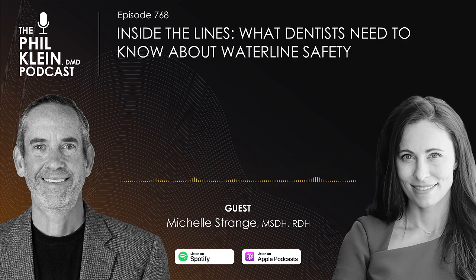It's the same thing in the mouth, right? It's your periodontal maintenance. We are busting up as much of that biofilm as we possibly can. We know we're not getting rid of bacteria, we just know that, but can we lessen it so for our patients there's less host response, and in our lines, throughout the days of using the treatment, we are able to let that low chemical keep the bacteria that's off seeding below 500 colony forming units.